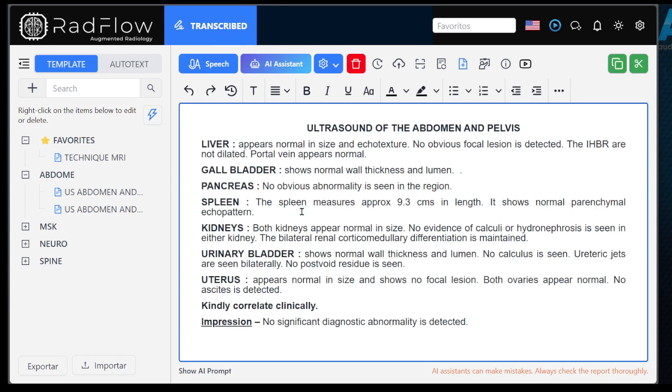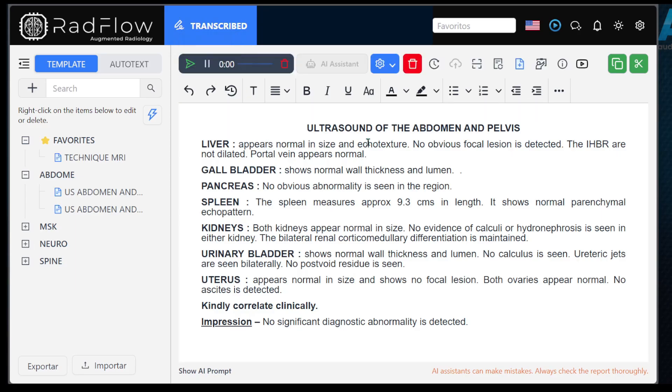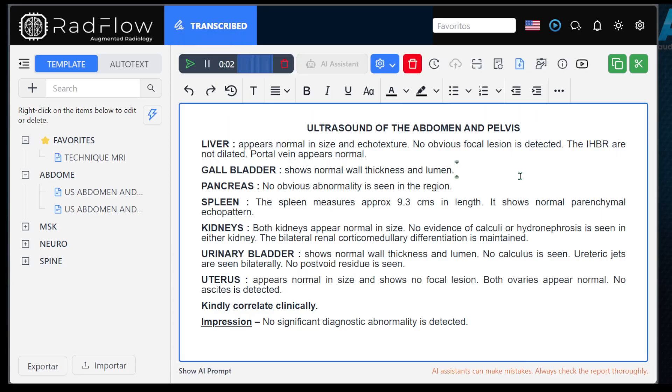You can also use it to make final corrections to your report. For example, presence of a bladder stone measuring 0.4 centimeters.